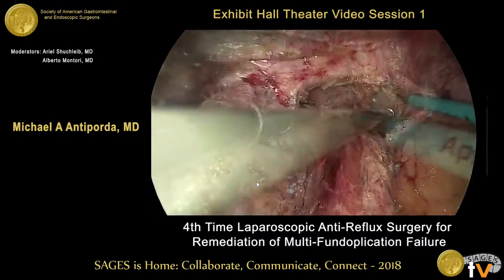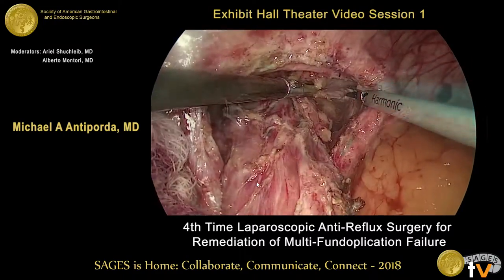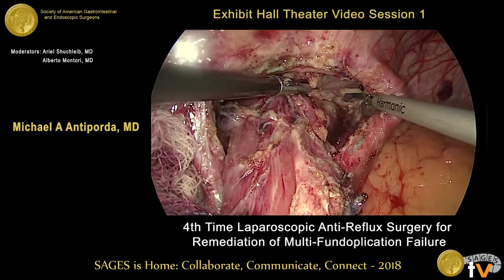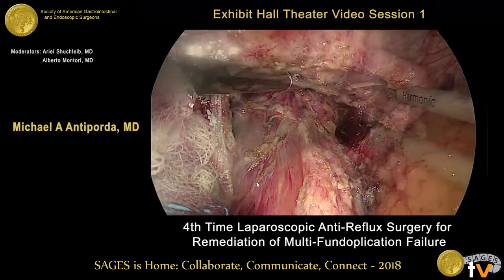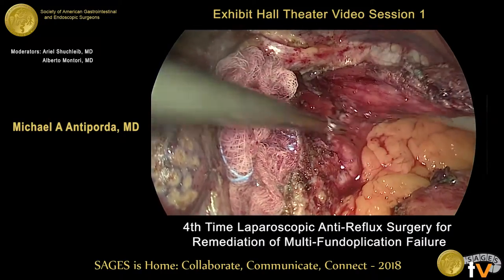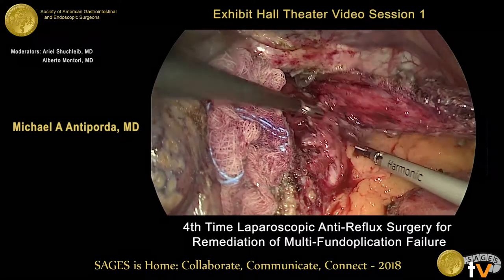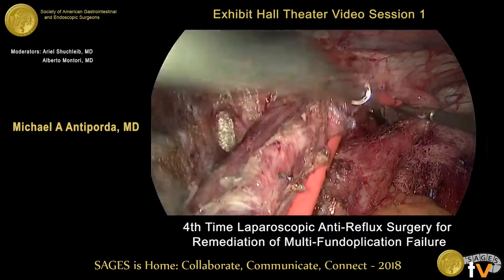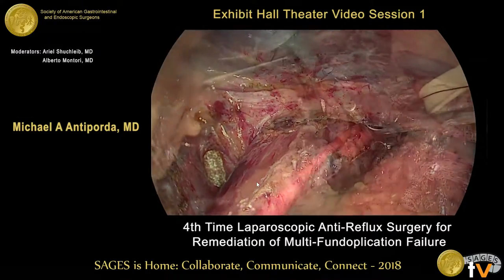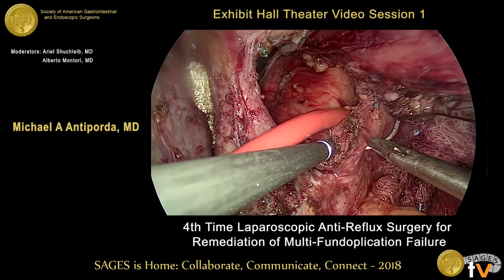The right crus is de-tethered from the inferior vena cava and the caudate lobe, and we enter the left pleural cavity intentionally with an ultrasonic energy device in order to induce intentional capnothorax. This helps with reducing tension on the crura when we perform a hiatal hernia repair. We place a red rubber catheter into the left pleural space, which will be used to evacuate the capnothorax at the end of the operation.